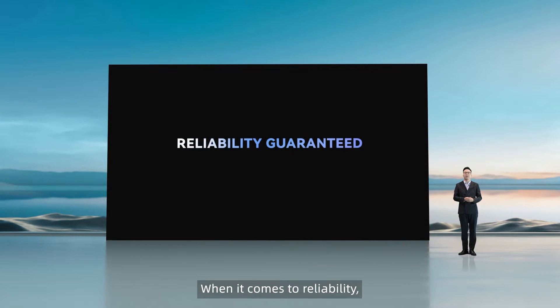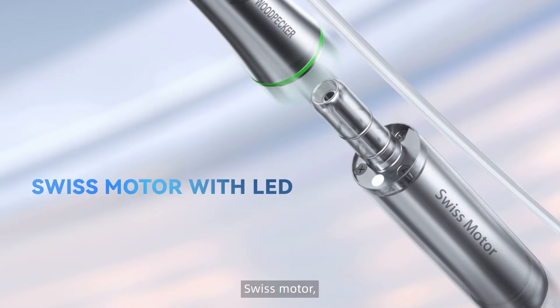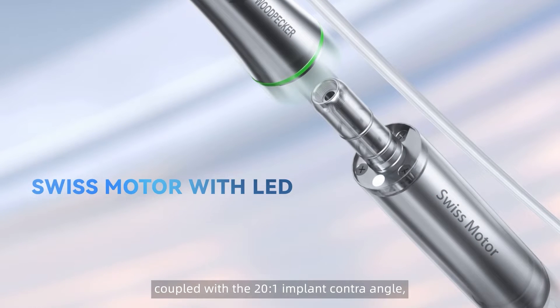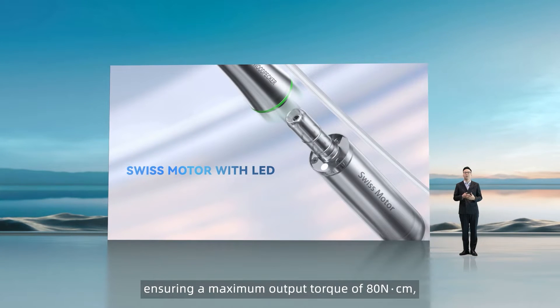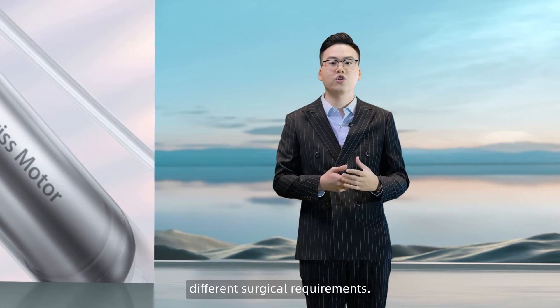When it comes to reliability, we've spared no expense. ImplantAir is equipped with a 5.5 NCM Swiss motor, coupled with a 20-to-1 implant control angle, ensuring a maximum output torque of 80 NCM, providing powerful performance to meet different surgical requirements.